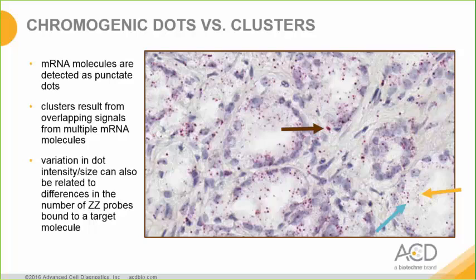In this image, in which the RNAscope chromogenic assay has been performed with a red chromogen, signal appears as numerous punctate red dots of various sizes and intensities and few clusters. It is the number of dots and/or clusters that are important, rather than the size of the dot or the intensity of the dot. Each punctate dot equals an mRNA molecule.